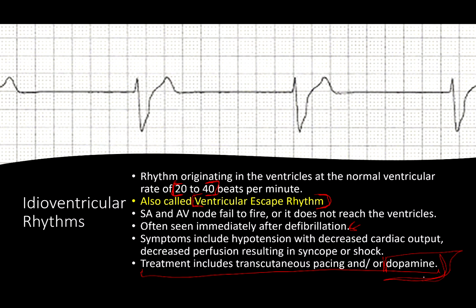Now what makes this really ventricular is look at this QRS complex. It's very, very, very wide and bizarre looking. It probably ends right about there. These are really hard to measure out because that end point is very hard to find, that J point.